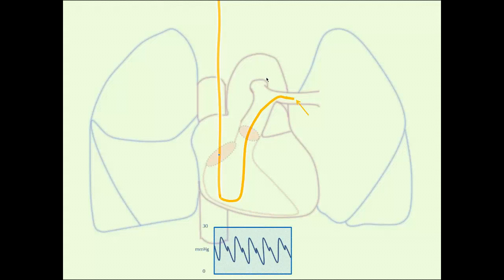So how do we measure the pulmonary artery pressures? Well, it's transduced from the very tip of the catheter here, and as we talked about in the first part, you get this nice pulmonary artery systolic pressure, this dicrotic notch, and the pulmonary artery diastolic pressure. And again, the pulmonary artery systolic pressure normally is well below 30, and the diastolic pressure can range sort of between 4 and 15, and the pulmonary artery diastolic pressure is a very good surrogate, barring any abnormalities in pulmonary vascular resistance, for your pulmonary arterial occlusion pressure, or your wedge pressure, as is commonly referred to.